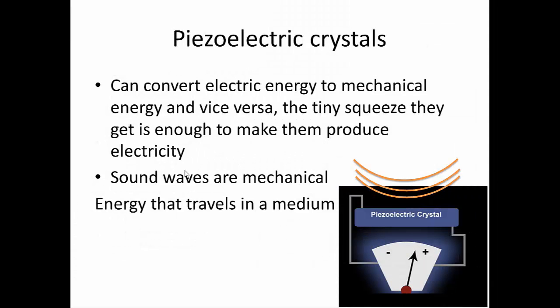Let me just say a couple of things about the piezoelectric effect. Piezoelectric crystals, as they used to be used in ultrasound devices, now they've changed to a slightly different material. They have the property that they can convert electric energy into mechanical energy and vice versa. So if you squeeze them, they will produce electricity. If there's an incoming sound wave, as here, when this crystal gets squeezed, you can see that the needle on the voltmeter will actually move and you create a current. On the other hand, if you apply electricity to them, or pulse electricity, you will create sound waves.